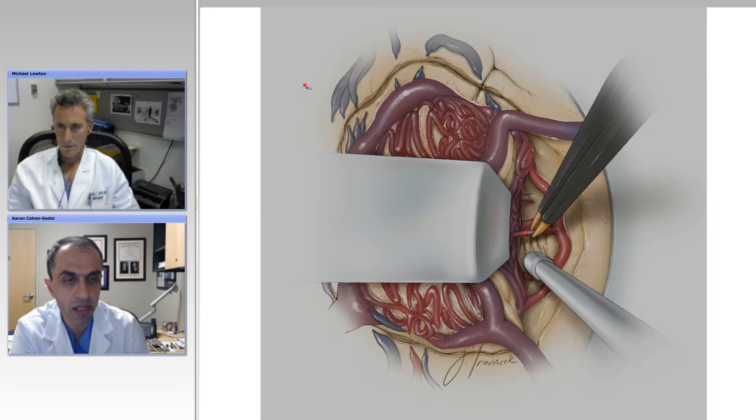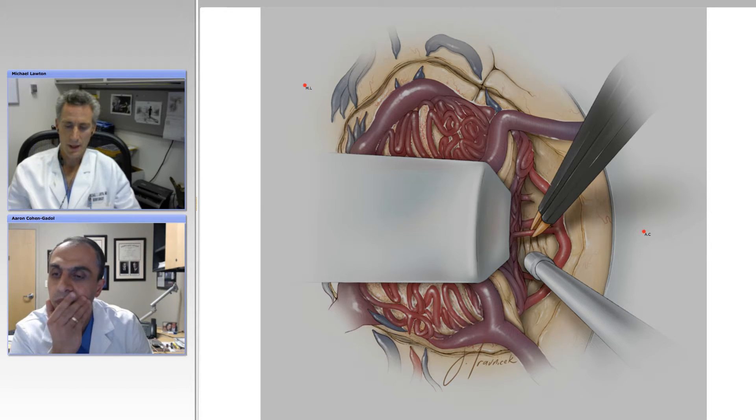You have to recognize that the deeper you get into the white matter, the increased likelihood of these red devils, as you call them, causing hemostatic problems. What are your pearls when you run into these feeders bursting within your bipolar blades? A couple pearls: one is you want to have the AVM microclips ready to go, because these thin-walled vessels simply won't cauterize, so you really need to use the clips.